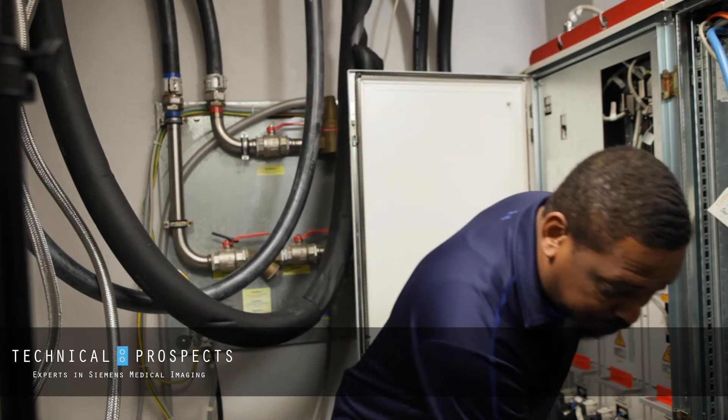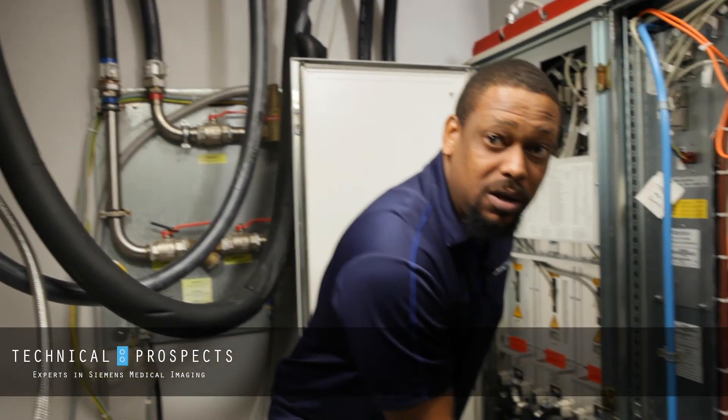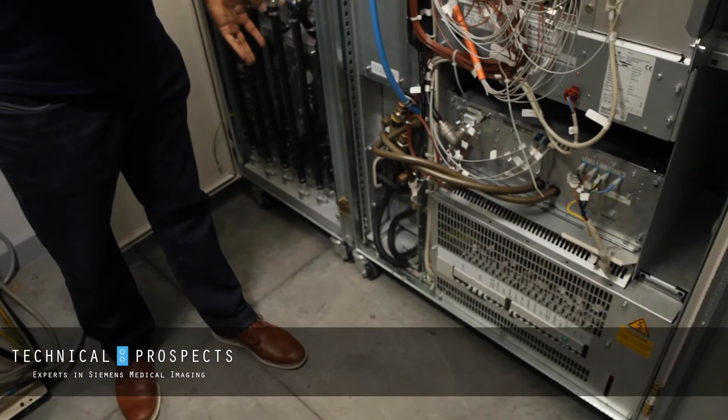Now, if at any point when you're checking for leaks you do come across a leak, the first thing you want to do is shut down your system at the console, then power it down, and come here and actually power down the cabinets as well. Then you'll address the leak as needed.